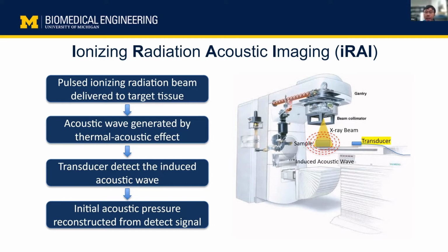The transducer can detect the induced acoustic wave and reconstruct the initial acoustic pressure. The initial acoustic pressure is proportional to the radiation dose delivered, which means we can use this technology with acoustic waves to resolve the radiation dose delivery.